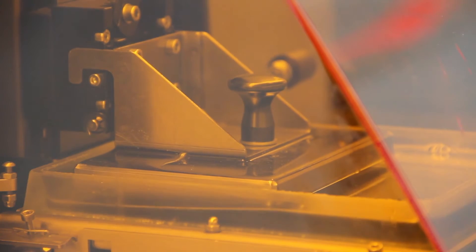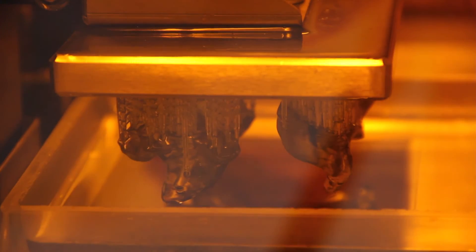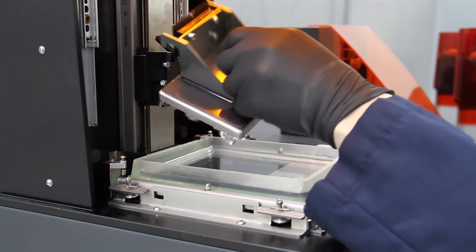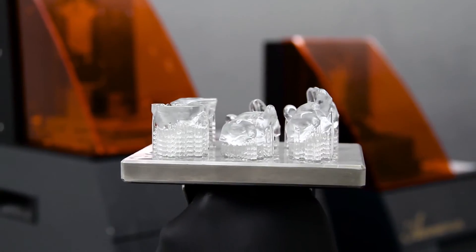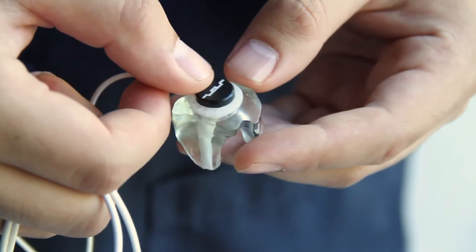Using Envision Tech's digital desktop shell printer, we will print our models in E-Shell 450 resin. Once we have removed our models from the machine and have post-processed them, we can snap fit our ear mold and in-ear headphones together.